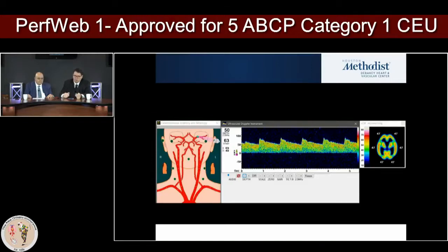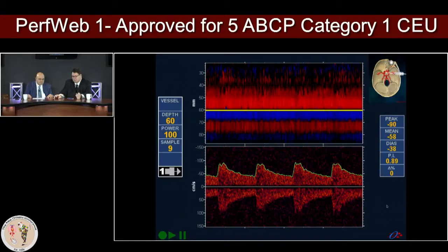And I forgot to show you, I just want to go back to the slide, that this delta percentage change on the bottom, if I push that for 100%, that would be my established baseline at the beginning of surgery, even before the general anesthesia would start. That would be the relative number, so I don't need to remember what my mean flow velocity was. I do not want to exceed about 20% flow changes. So 20% is what we can communicate clearly: I have a 20% drop, and that alerts the anesthesia as well as the surgeons that we have a flow change.